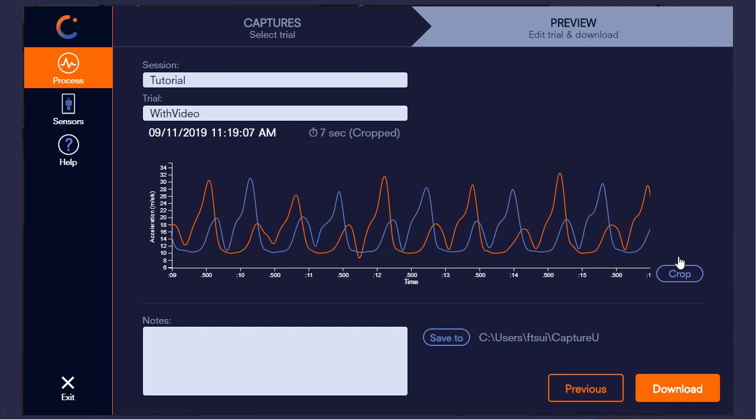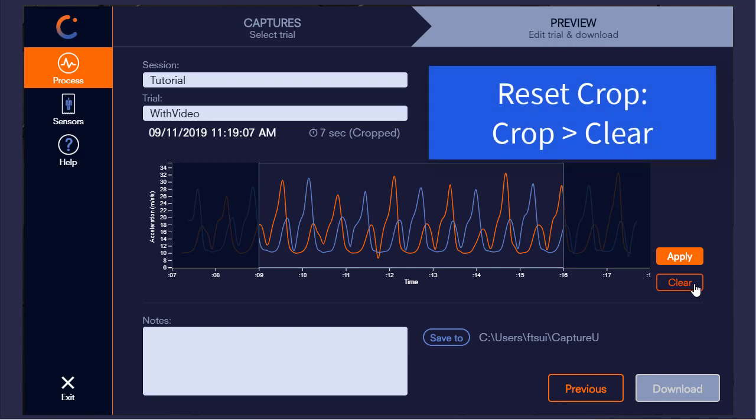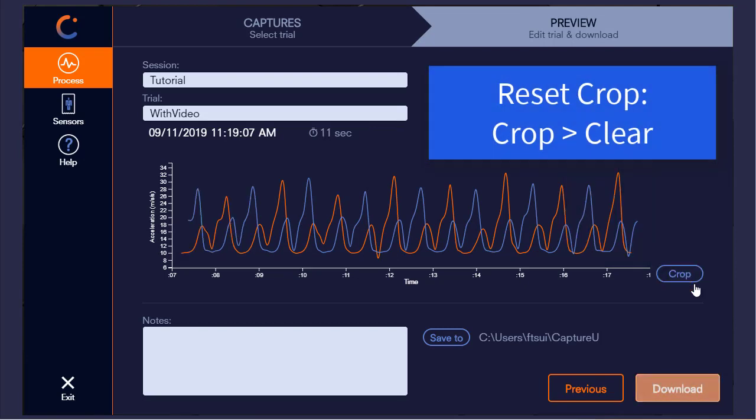Note that you are not deleting any data outside of the crop, and you can reset the region by clicking crop and then clear.